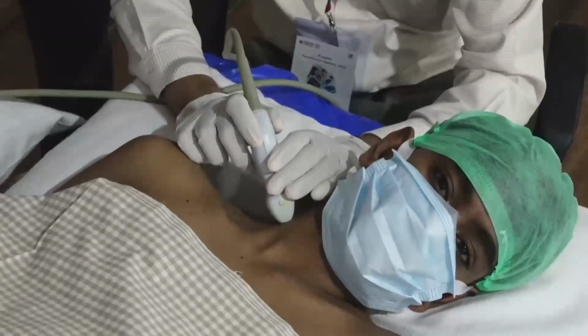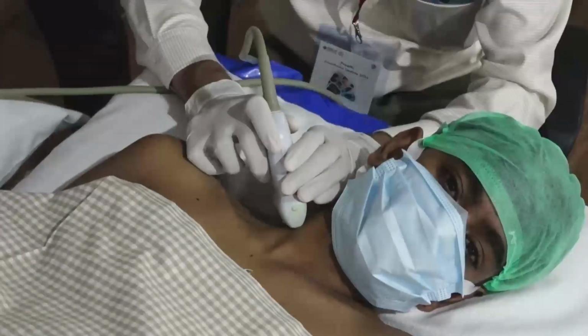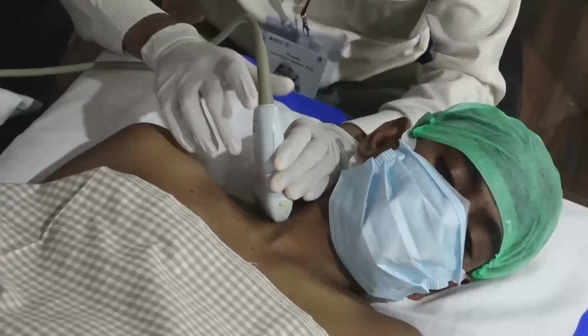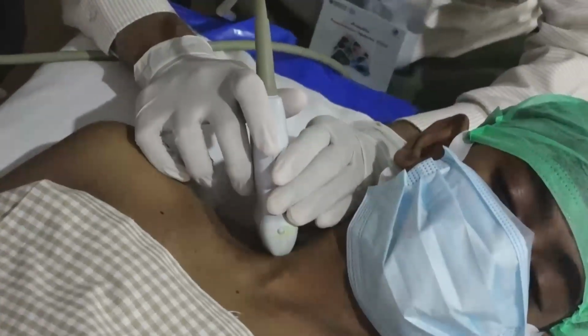We all know upper trunk is formed by C5 and C6. So after tracing individual components, I will trace down and come and show the C5 first. The neural element, whatever you are seeing first, it is C5.